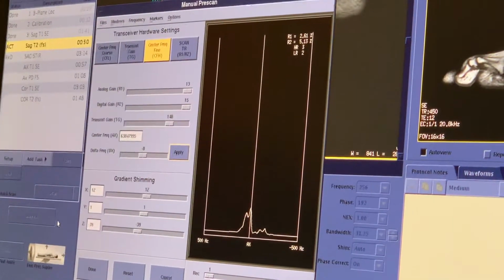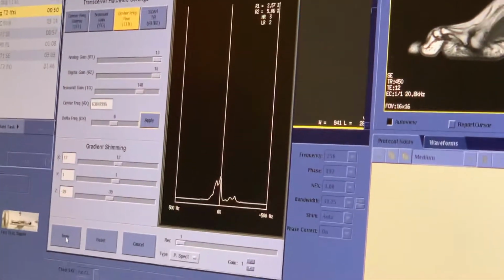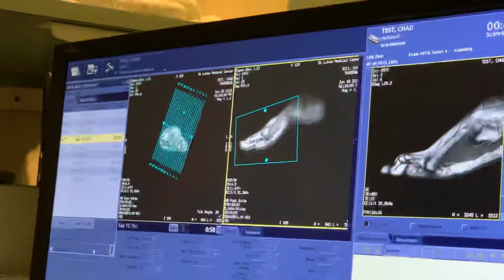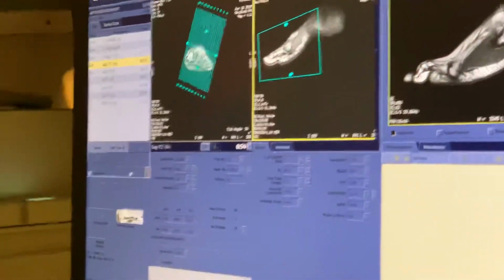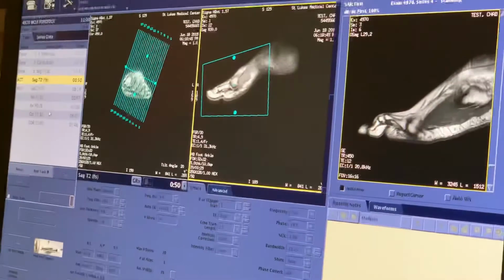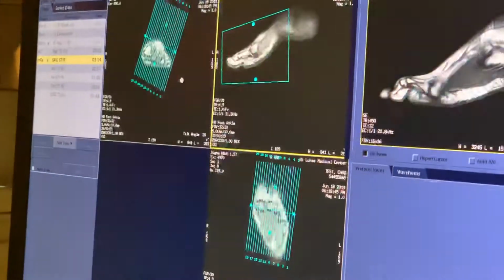So by manual pre-scanning, you have the highest probability of getting a good fat saturation. So you hit done, and then you hit scan. Okay? So you're going to have to learn to do that, because that's not something that the scanner does automatically over there.